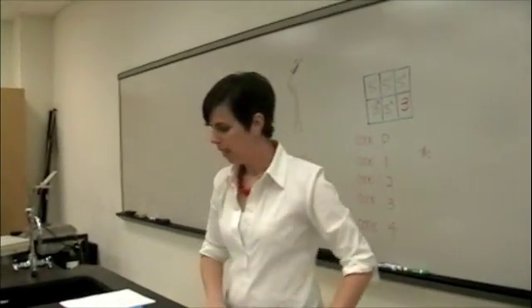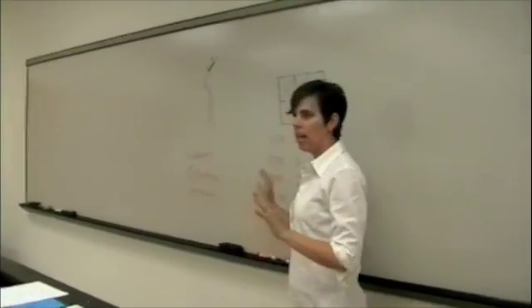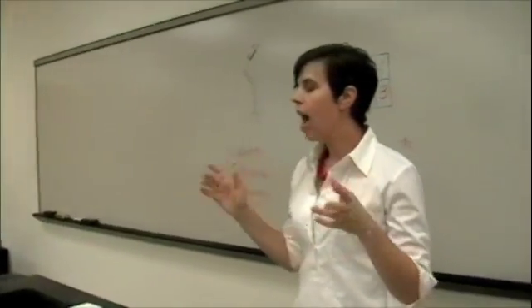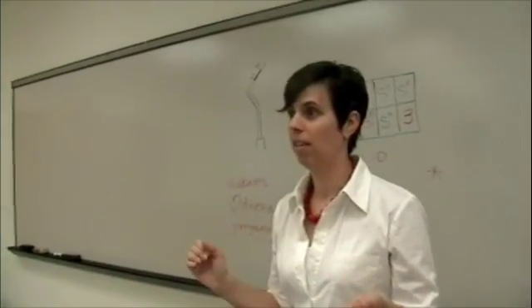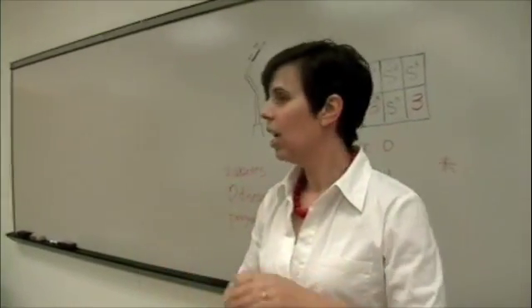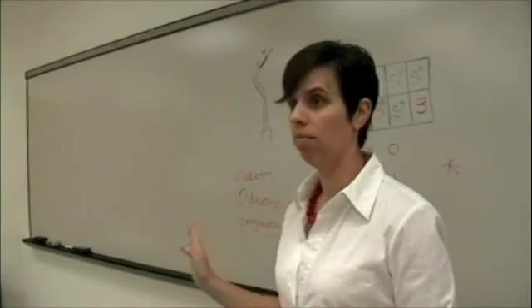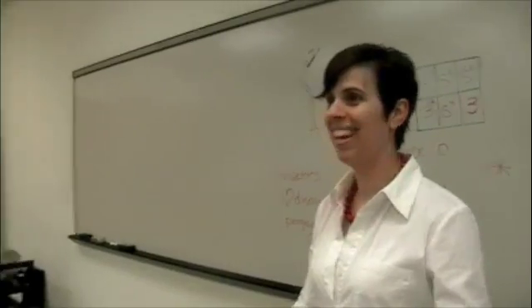If I do this and I record it all, I'll usually make a note like, oh, recession on 214 or whatever. Okay, so let me point out something really important though about the PSR: it is not meant to replace a comprehensive periodontal assessment. Let me just say that right now. You cannot replace the comprehensive perio assessment with the PSR. Now you're wondering, well then why are we learning this?